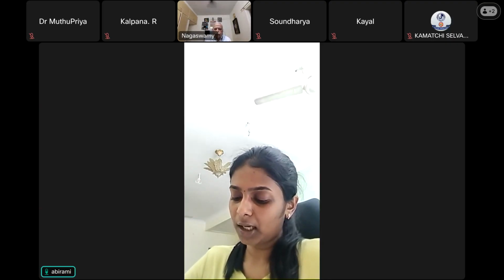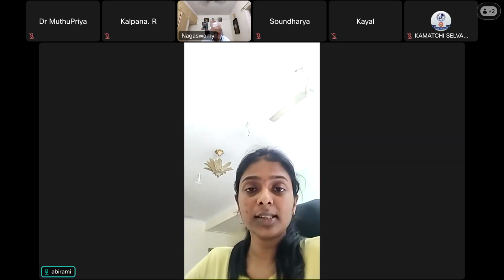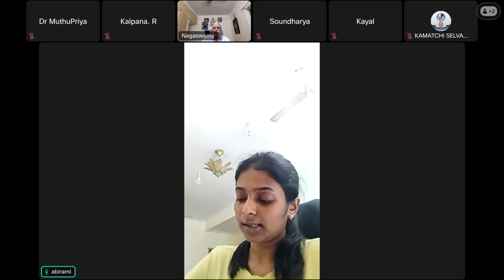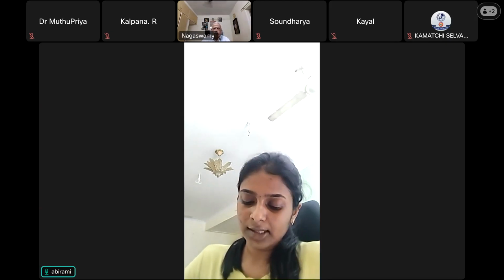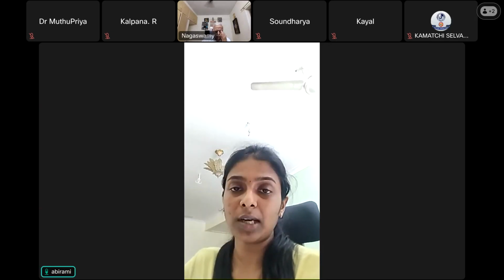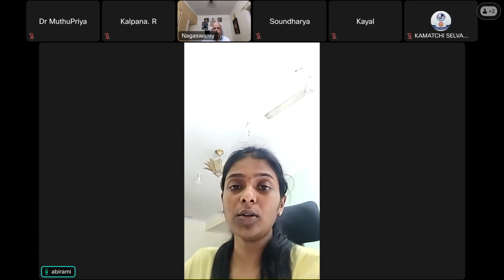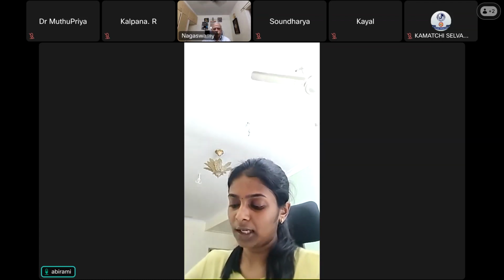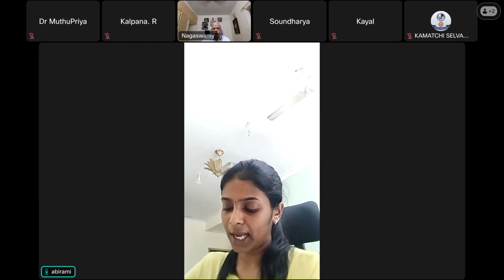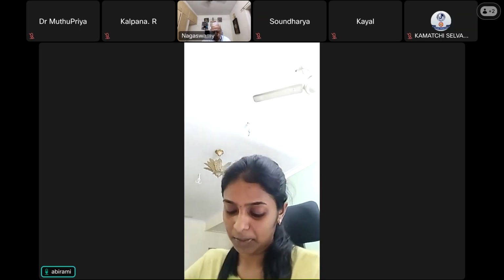The paramagnetic O2 analyzer is the most commonly used. The analyzer circuit consists of two chambers separated by a pressure transducer. The sampling chamber receives the sample gas containing O2, and the reference chamber receives room air. Oxygen molecules have an unpaired electron in the outer ring, which makes them paramagnetic and attracted in a magnetic field. This forms the working principle.